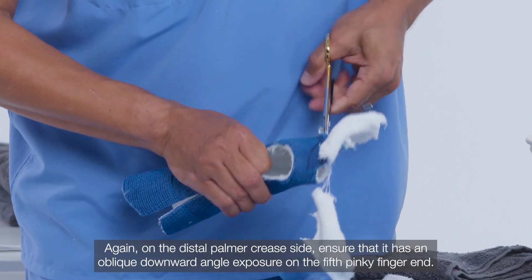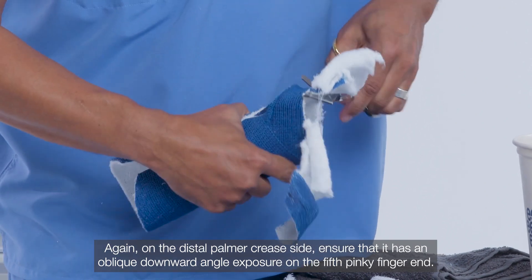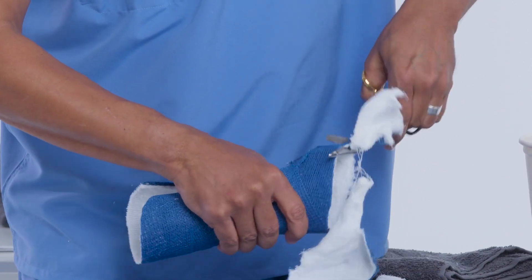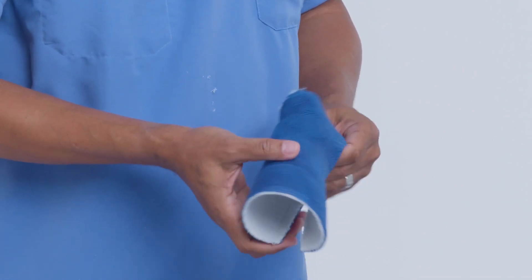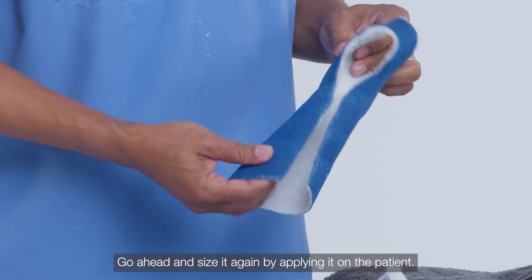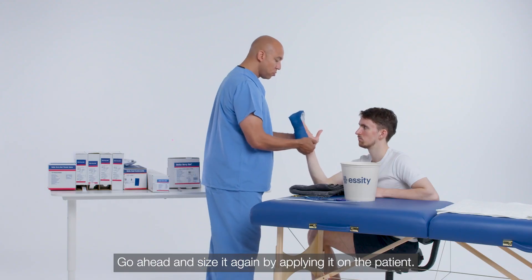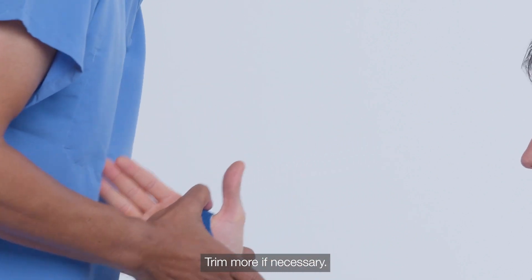On the distal palm or crease side, ensure that it has an oblique downward angle exposure on the fifth pinky finger end. Go ahead and size it again by applying it on the patient. Ensure you have the best fit possible — trim more if necessary.